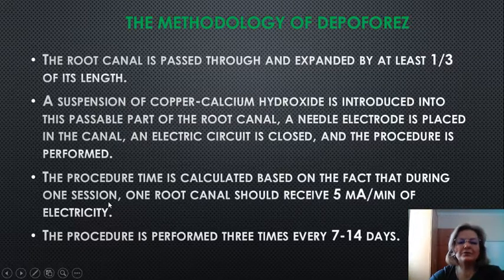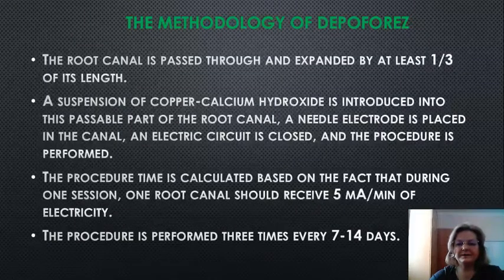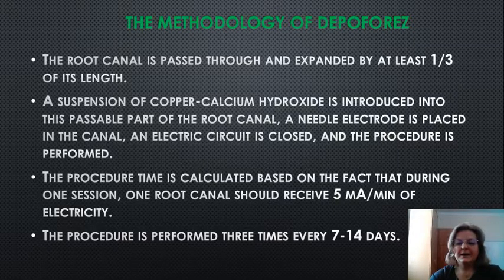And a suspension of copper calcium hydroxide is introduced into this passable part of the root canal, and a needle electrode is placed in the canal, and the electric circuit is closed, and the procedure is performed.